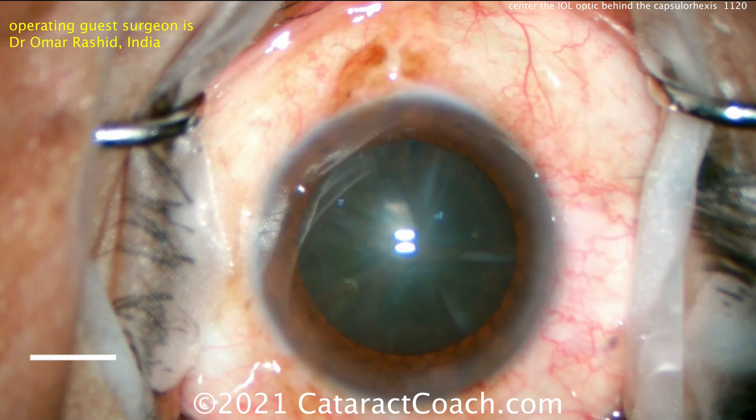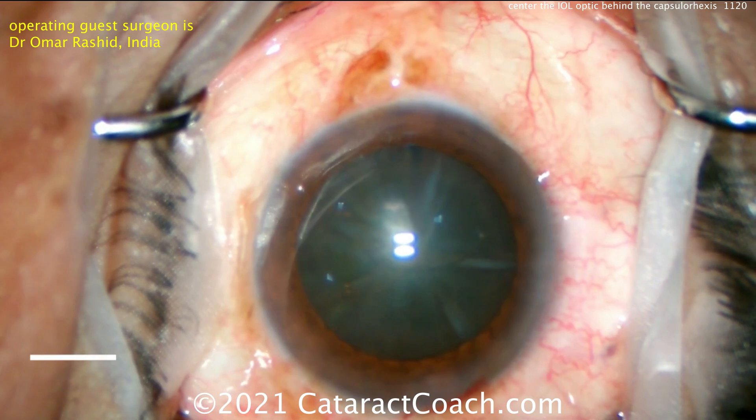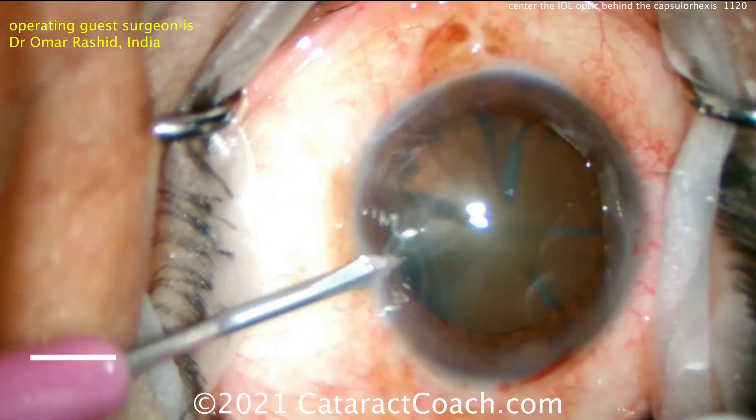That looks like a very nice incision here — a case with a moderate cataract. Making one side port incision there and looks like another one on the other side. Very nice technique here.